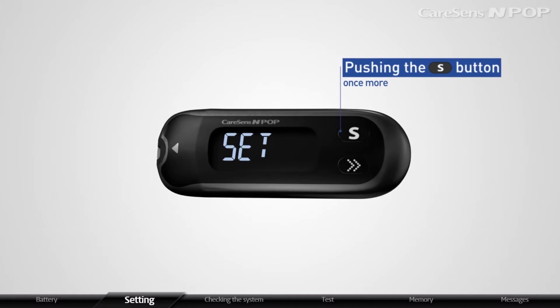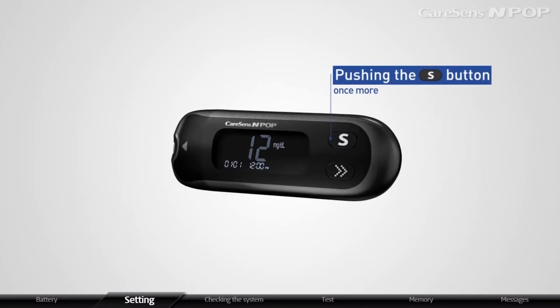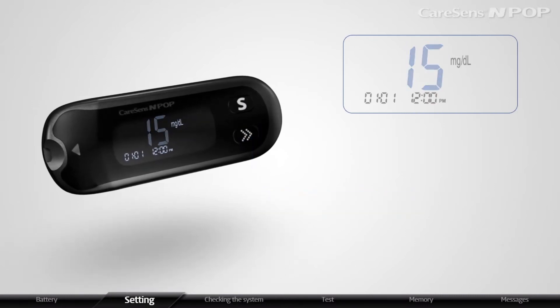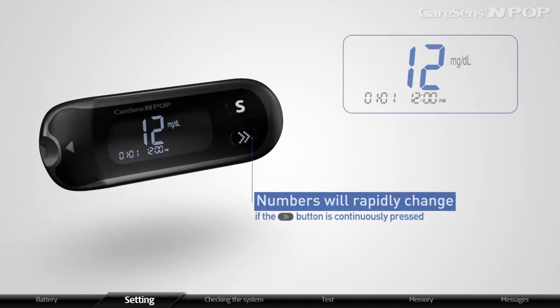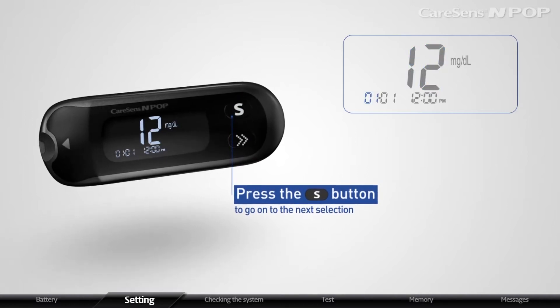The meter will display year settings by pushing the S button once more. Please set the correct year by pressing the arrow button. Numbers will rapidly change if the arrow button is continuously pressed. After setting the year, press the S button to go on to the next selection.